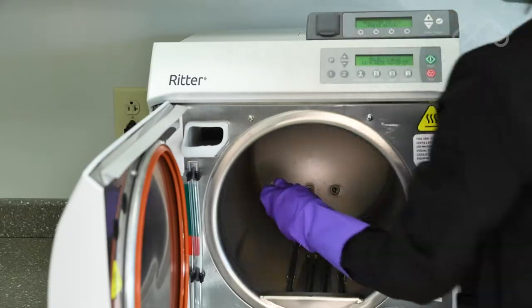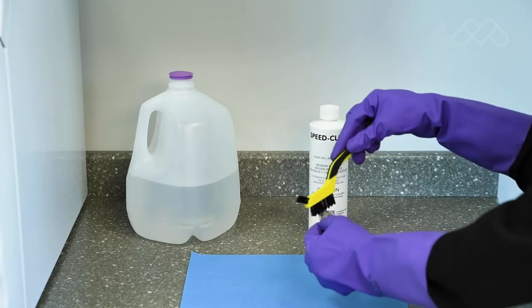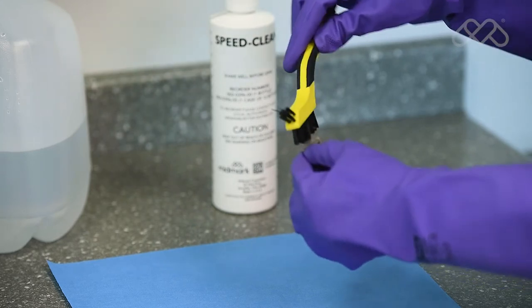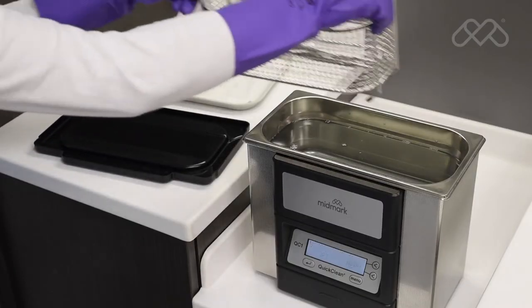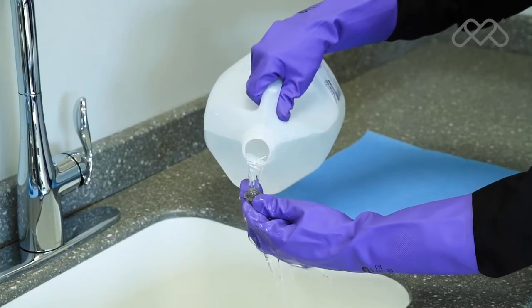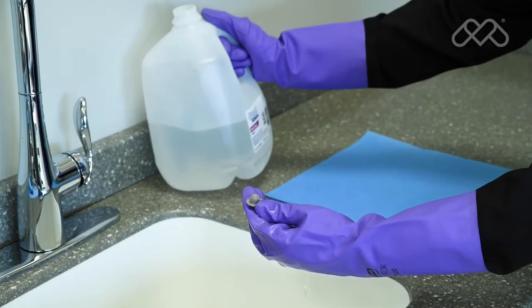Remove the filters by pulling upward and twisting slightly. Filters should be cleaned by washing with SpeedClean and distilled water solution. Use a small stiff brush or an ultrasonic cleaner to remove stubborn deposits. After cleaning, rinse the filters with distilled water and set them aside.